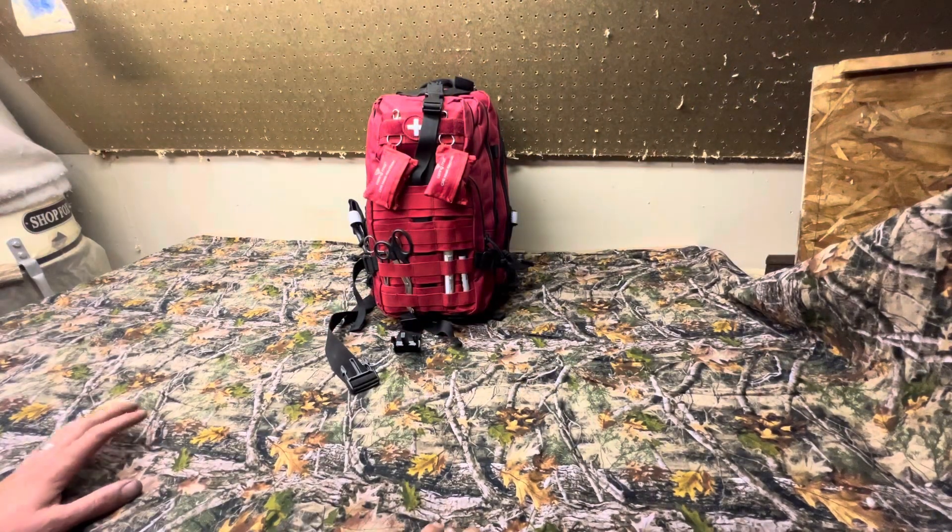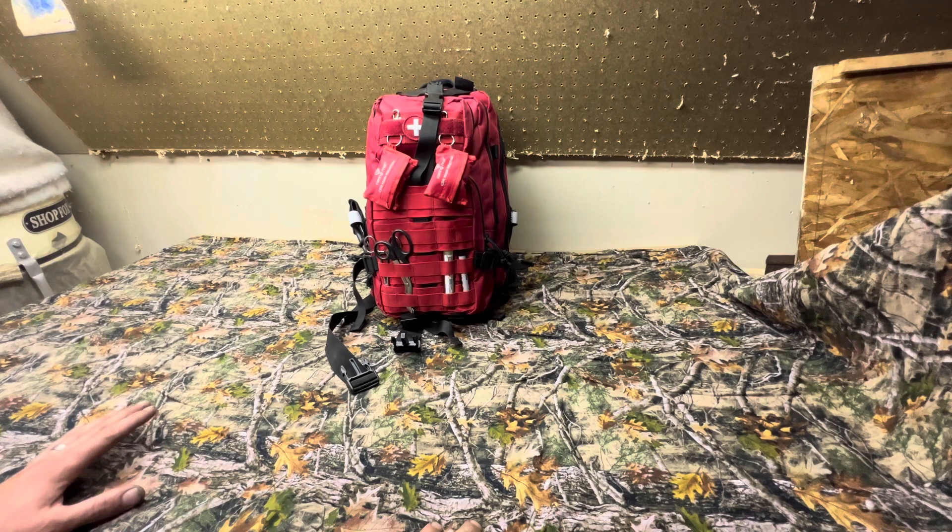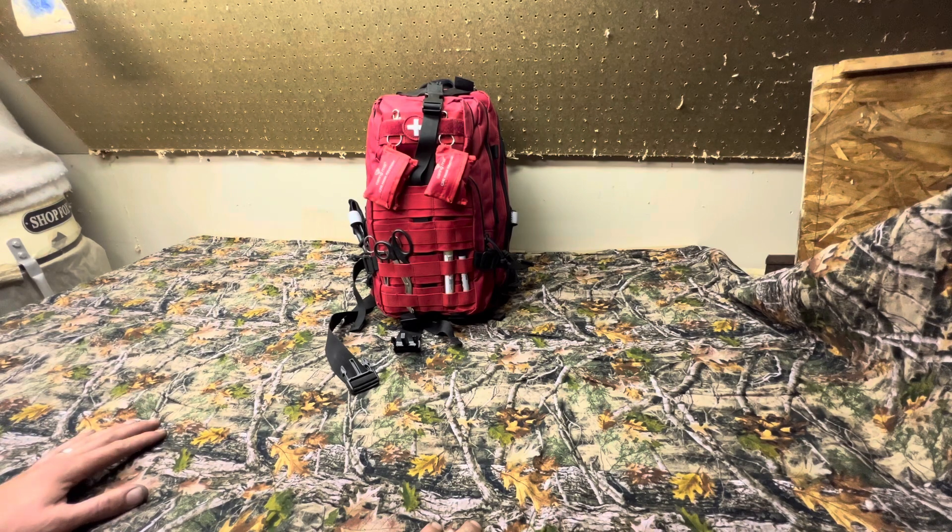Hey everybody, due to the popularity of my get home bag breakdown, I wanted to give you guys an extra special one. This is a family medical kit that I put together a couple of years ago and I've been adding a little here and there since. Basically this is our emergency kit that we bring with us on road trips, camping, hunting, or anywhere you'd want medical assistance before a paramedic can get there. When you suffer a major laceration and blood is gushing, seconds really matter. Having the proper tools and training is essential.